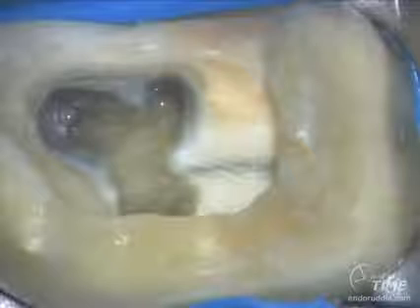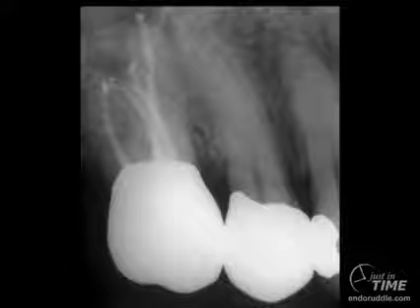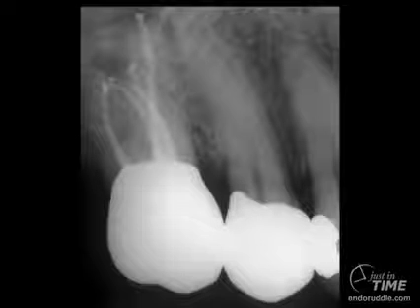Notice the finishing is done with two instruments. I keep repeating, the surgical length diamond, and in this case we use the auxiliary Gates. We could have used the auxiliary ProTaper shaper. Well, we can go ahead and provisionalize the casting, but you can see 4 systems, 5 portals of exit, and this is what makes endodontics fun.